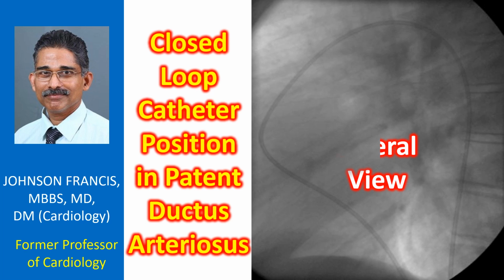The image in lateral view shows the right heart catheter passing through patent ductus arteriosus into descending aorta. Spine is visible on right side of the screen. Right heart catheter coming through the inferior vena cava below the diaphragm is coursing anteriorly as it passes through the right atrium, right ventricular outflow tract and pulmonary artery.